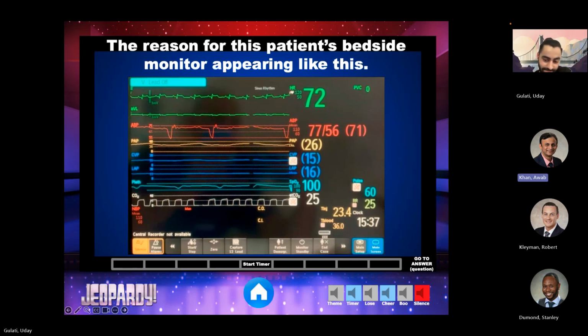That's what I was thinking, no, it's not, because there's a pulmonary artery pressure, PAP, right? It's not the same, so. It doesn't have like electrical alternans. CVP and the atrial pressure should be roughly the same. The question I have is, why is your arterial line only beating like that, compared to the electrical rate of 72? Yeah.